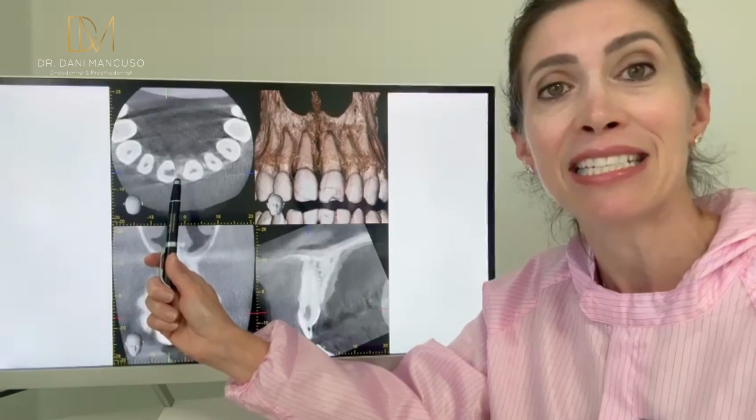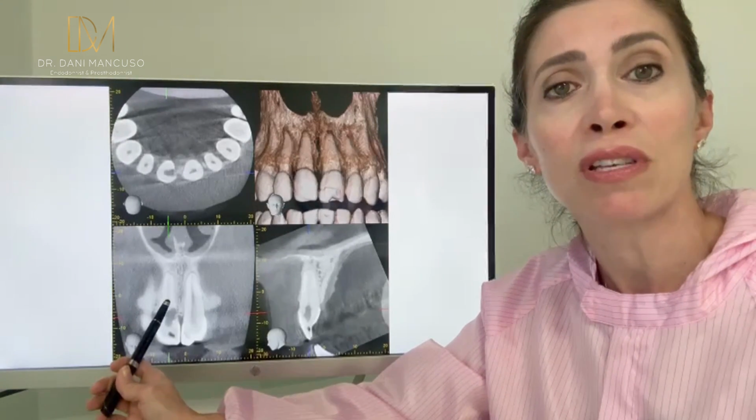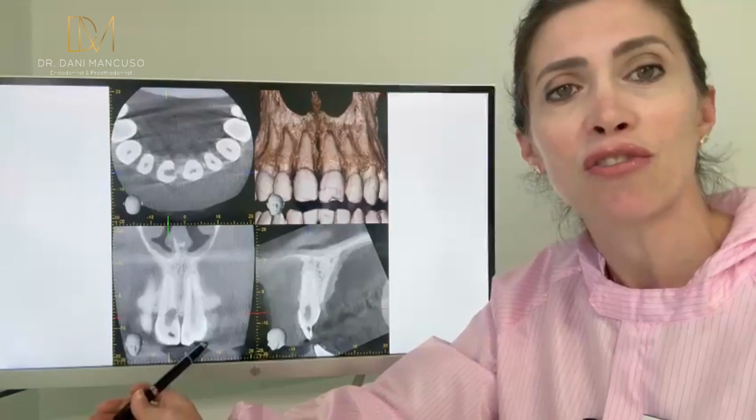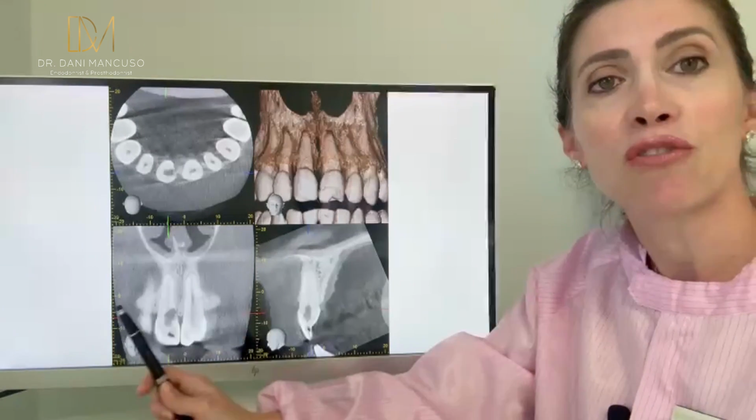So this patient was referred to me, and as you can see, it is a quite large external cervical resorption and is interdental on that upper right one. In this case, the patient didn't have any sensation to endofrost, so this tooth was completely necrotic and needed a root canal treatment. The cervical resorption was already inside of the canal, and in this picture, you can see a little bit better, an extra one over there.